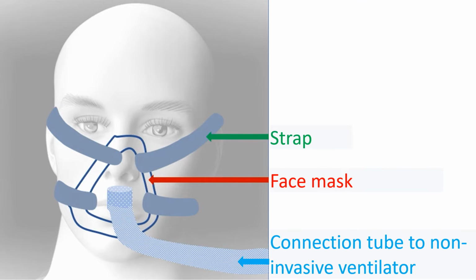Non-invasive ventilator is usually a smaller device with less sophistication. It is connected using an external mask which is tight-fitting over the nostrils and mouth. A good air seal at the mask face interface is needed for proper functioning of non-invasive ventilator. Too tight mask can cause skin injury and discomfort to the person.